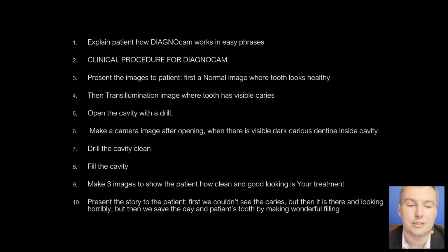We explain to the patient how DiagnoCam works in easy phrases, with a magic word like laser device. Then we do the clinical procedure that we discussed before. After the clinical procedure, we position the patient. We show him the large screen. We present the images of the tooth to the patient.